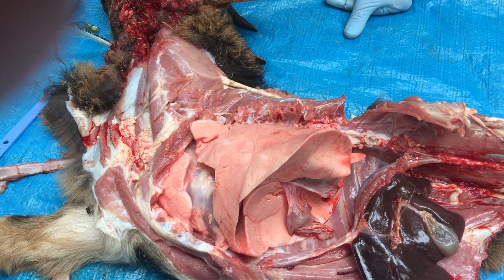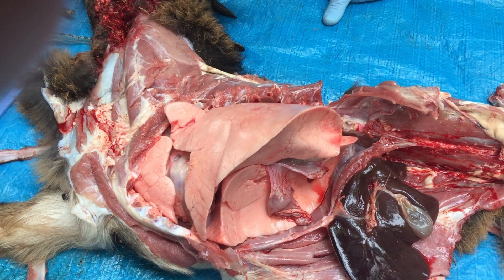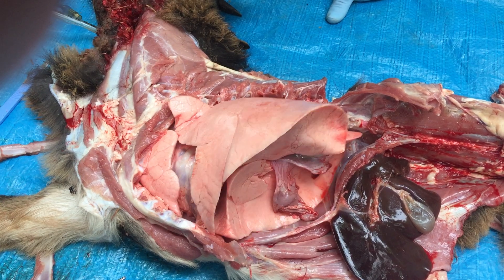So in the old days, do what we used to do in the old days, Callum. Boom — okay, so that's what we used to do. If we talk about hyperinflation of the chest, that's what we were doing, and quite fast like that.